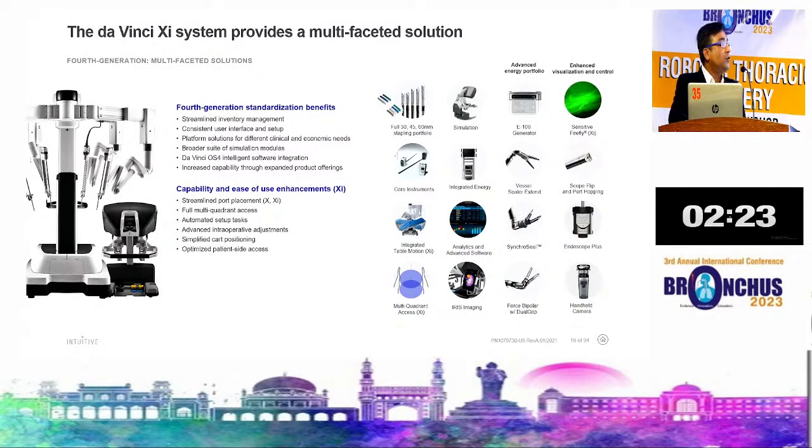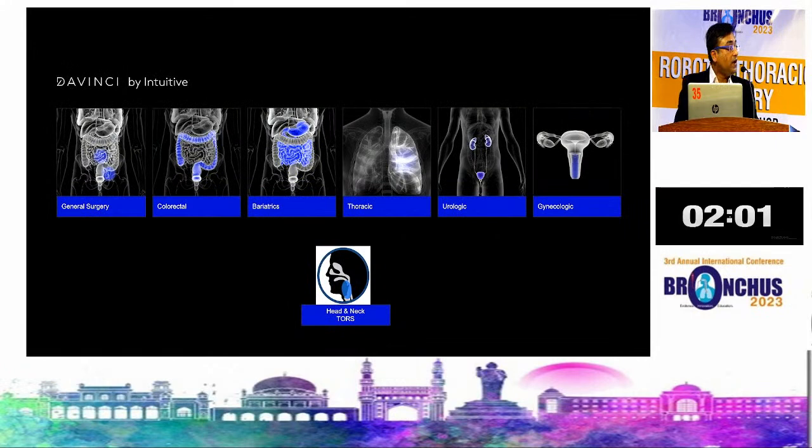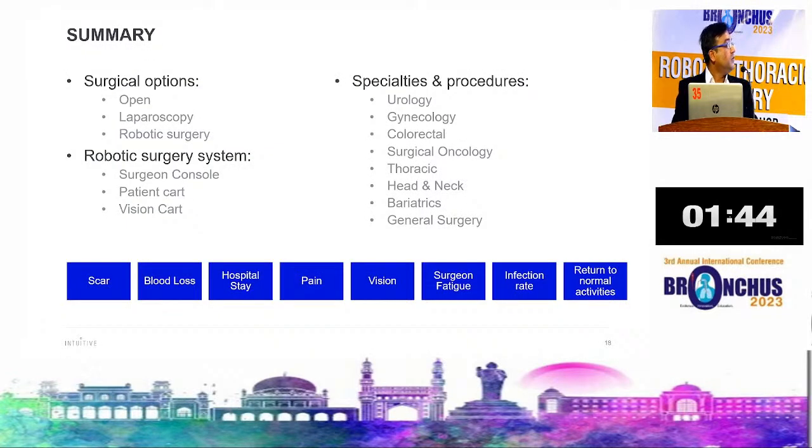Coming to the fourth generation systems, which is very specific, I guess, for all thoracic surgeons, is to have complete autonomy of the entire system. Hence, the entire system is bundled up with all the specific technologies that we have over here, which drastically gives the surgeon much greater autonomy in order to attain better results for the patient. So we are into a lot of specialties that can be operated with a single Da Vinci robo, and as Dr. Hemant was emphasizing, how to build a robust robotic program by involving as many specialties as possible.